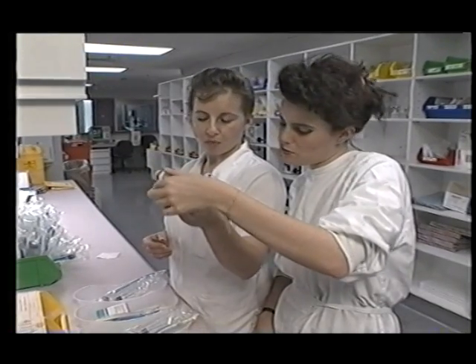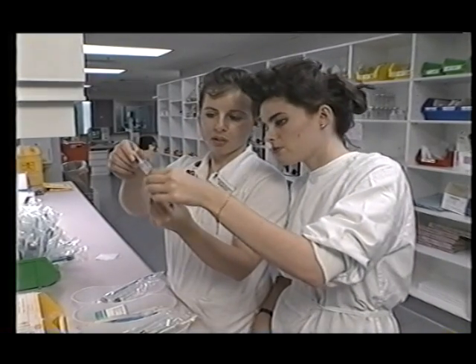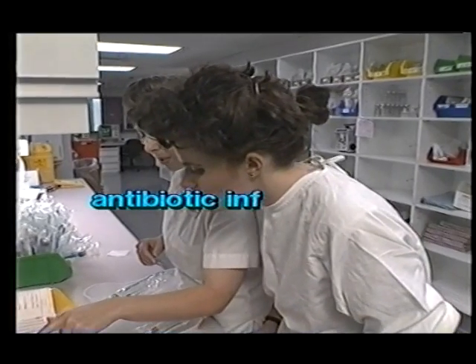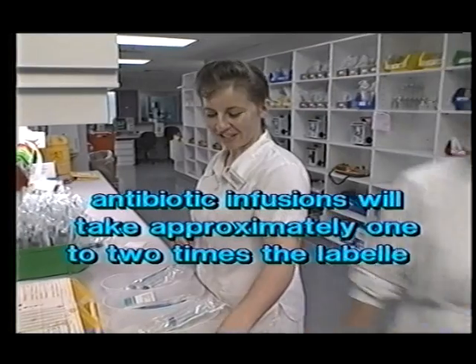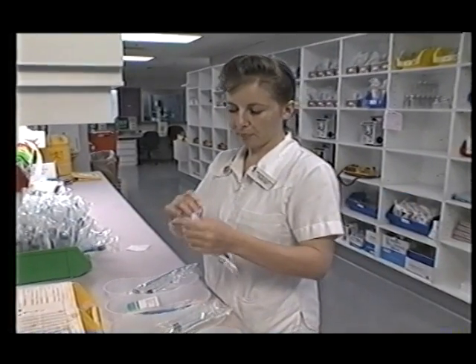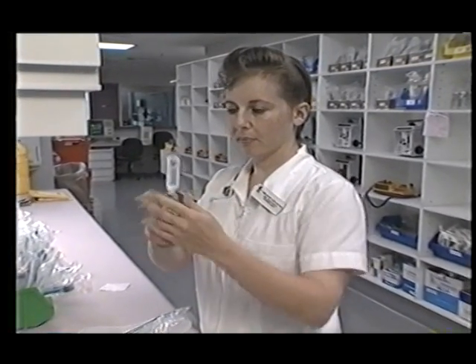However, as the viscosity correction factor of antibiotic solutions is usually in the range of 1 to 2 times saline, all you need to remember is that antibiotic infusions will take approximately 1 to 2 times the labelled infusion time. So with 10 mils in 5 minute flow control tubing, a 10 mil infusion will take from 5 to 10 minutes.